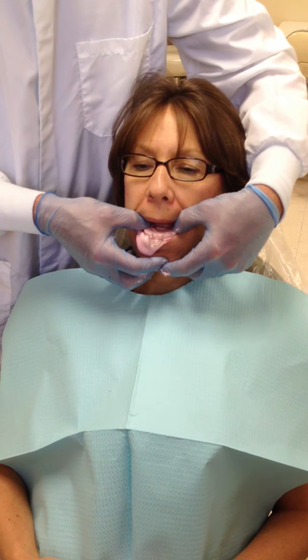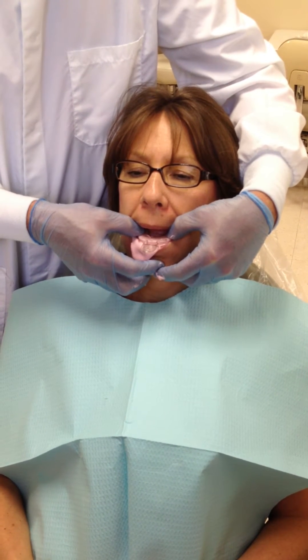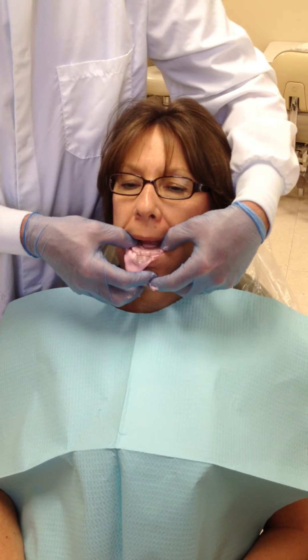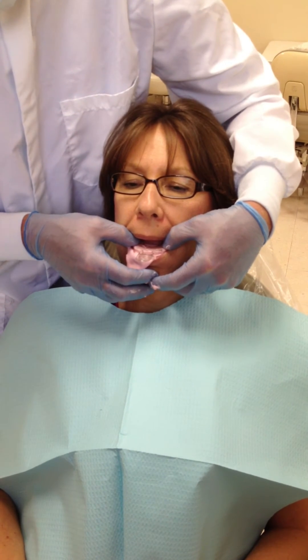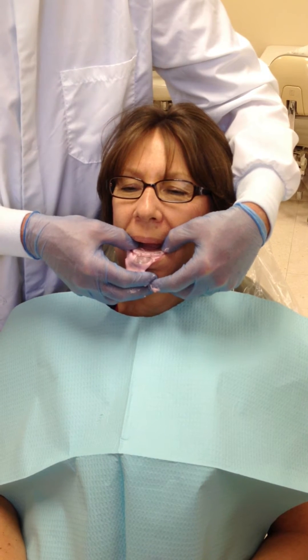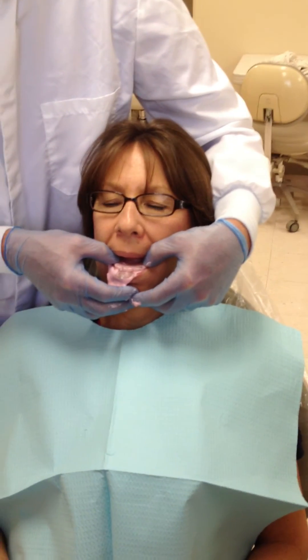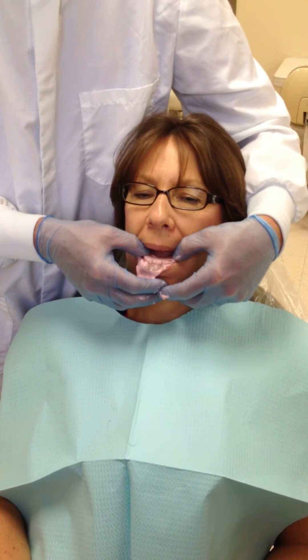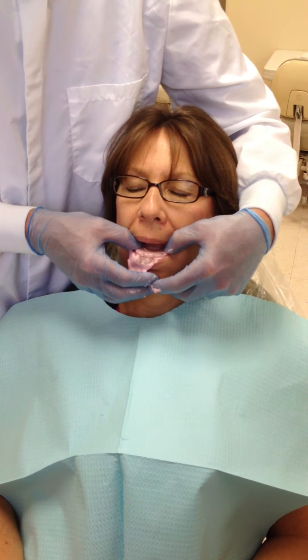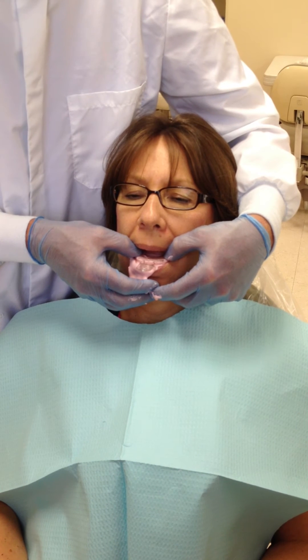Head down. The impression of her chin — I've gotten that with the extra material. It's still glossy, so we know that it's not set. When it loses the gloss and gets a dull appearance, we will know that it is set. If you do happen to get some alginate on your patient's face, it's always better to let it set first before you try and clean it up. It's easier to remove — it will come off all in one piece. If you try and remove it while it's wet, you will smear it all over and make a much more difficult cleanup.